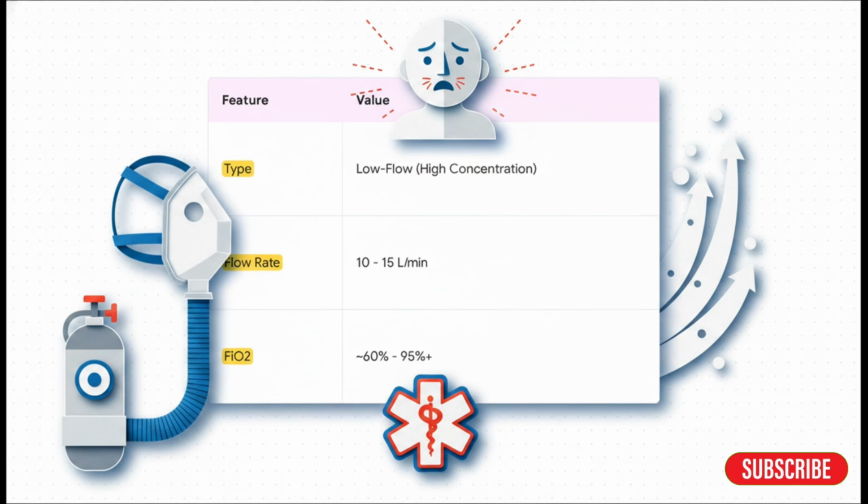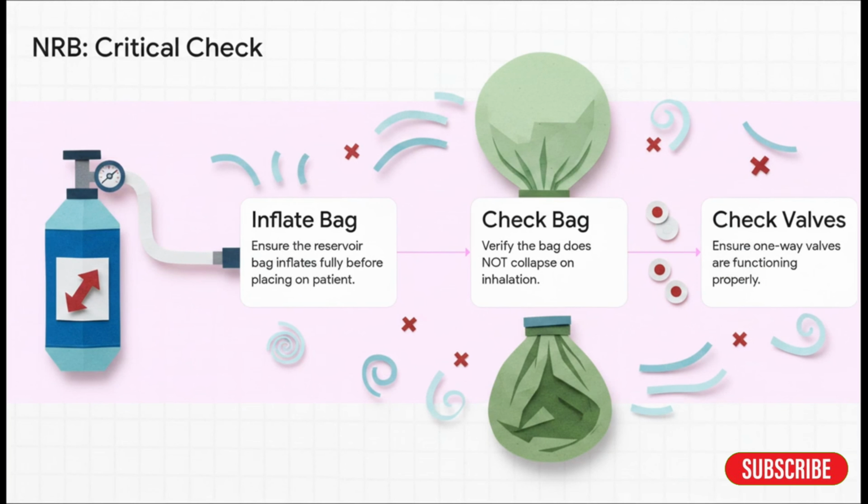We're doing that to deliver the highest possible oxygen concentration we can get from a simple mask. We're talking 95% or even higher. And this might be the most important safety check in this entire talk.